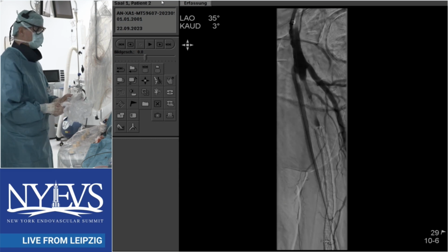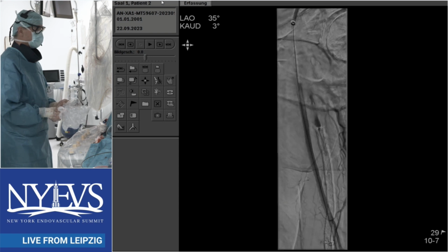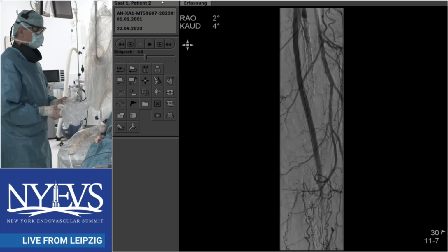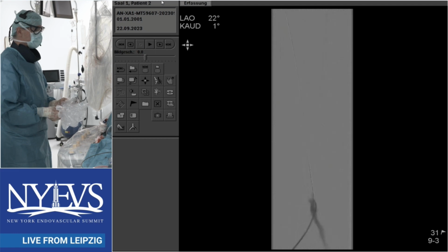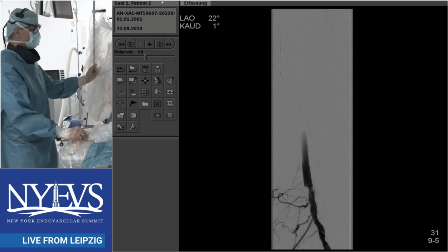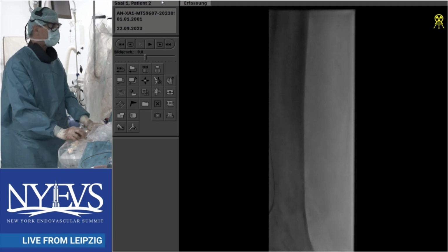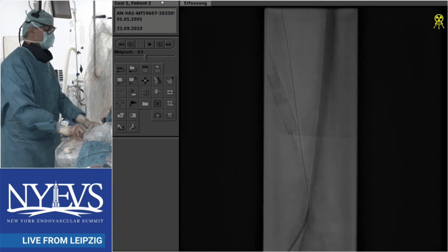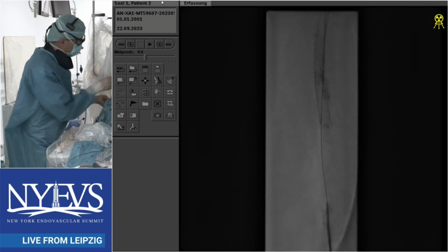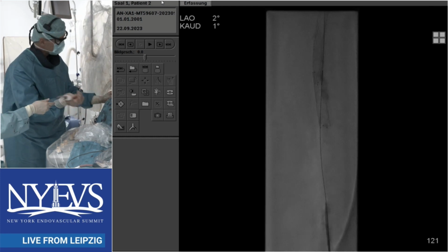Yeah. So first of all, I think Rotarex nicely cleaned that graft. We need to look closely at the proximal anastomosis. Here, I think the problem is a distal anastomosis stenosis. You can see this in another angulation, but altogether I think Rotarex did a good job so far. Now we hopefully can finish this all together as a good job.